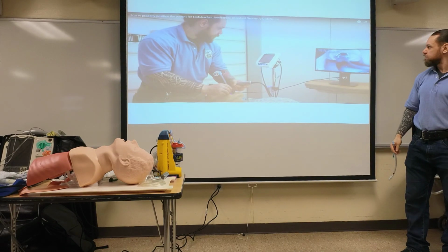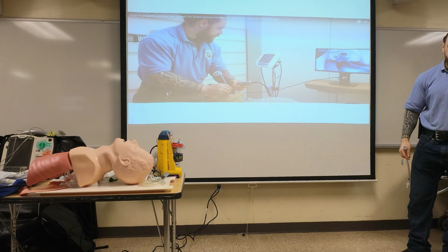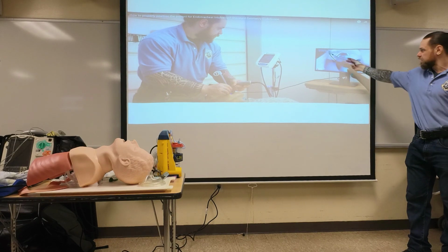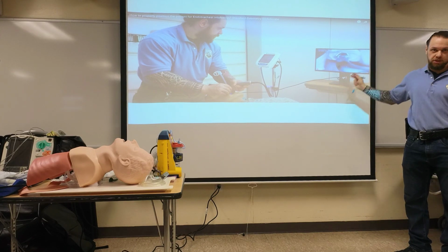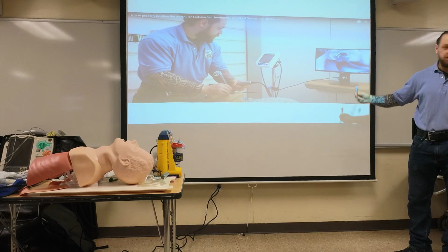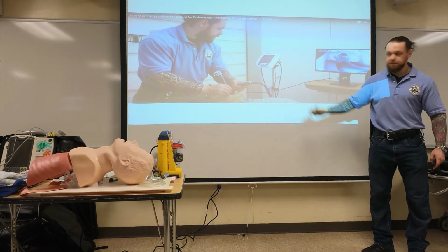I have a video. I'm not going to show it. You can go to the channel and watch it yourself. The difference is this: why I show it is because that video has the screen where you could see the structures. When I do the demo, you're not going to see this. Any of you watch this? Yeah, you watch this. Next time, this is called a video laryngoscope.